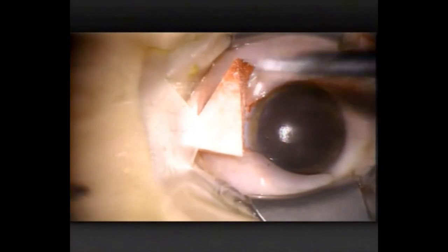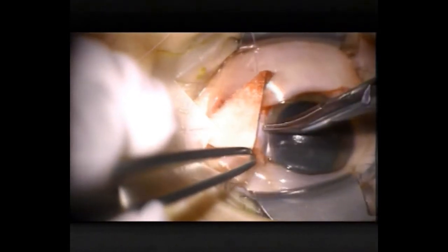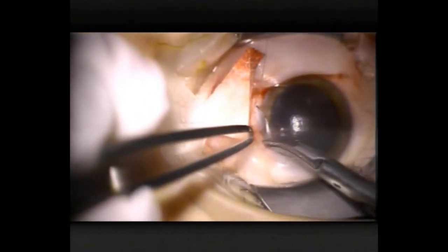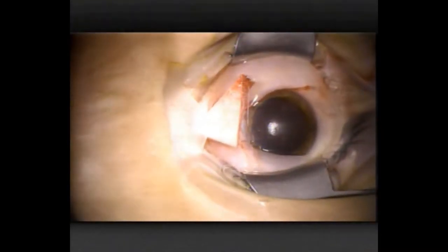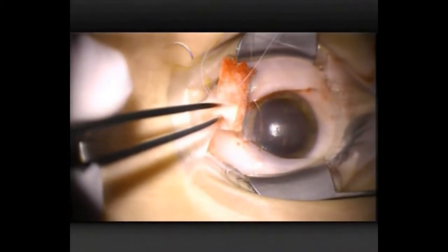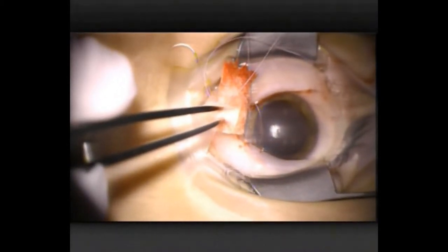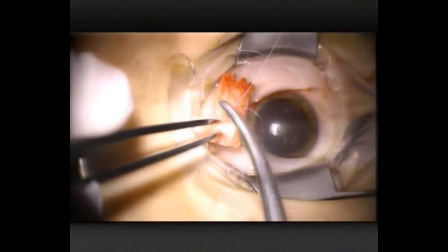Now I'm putting in an 8-0 Vicryl stay suture through the paralimbal cornea medially. With this I should be able to control the position of the eye. I drape the 8-0 Vicryl across a fragment of a sponge and then clip it with artery forceps — the sponge means that the artery forceps don't cut that suture.